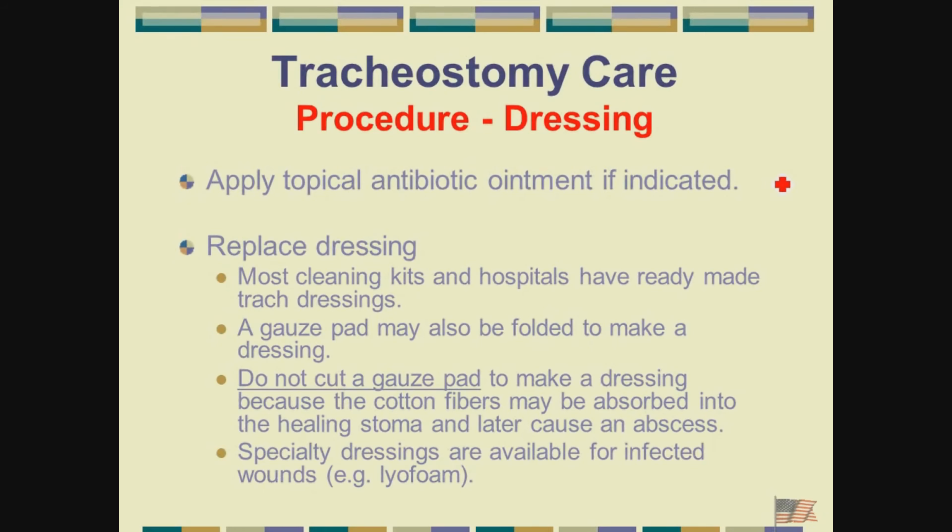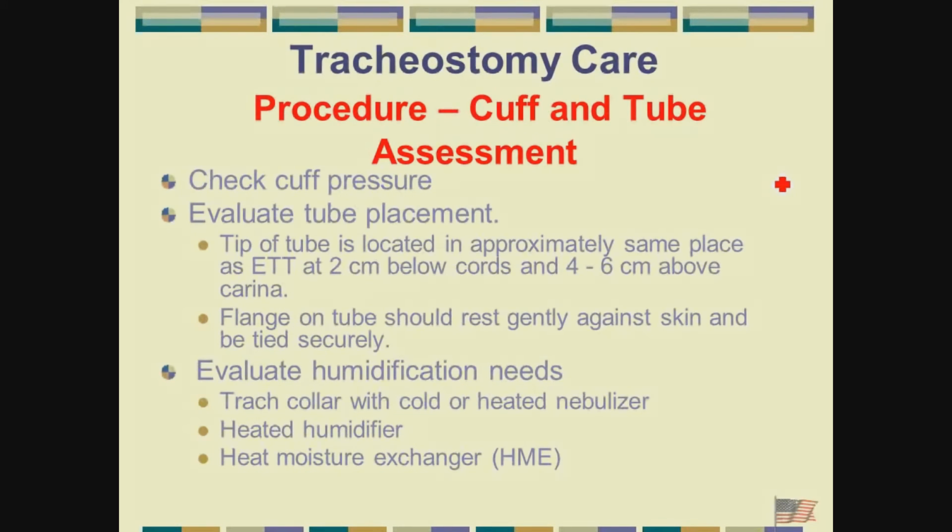One thing you never want to do is use a standard gauze pad and cut it yourself. I don't know if you've ever looked at a gauze pad, but when you cut it, there's all kinds of microfilaments that fly all over the place, and they get into the wound, and it's just nasty. These tray kits are designed for that purpose, and they're manufactured in such a way so they're not open. And there are some specialty dressings that you can use for wounds that are really infected. For our purposes, we don't worry about that.